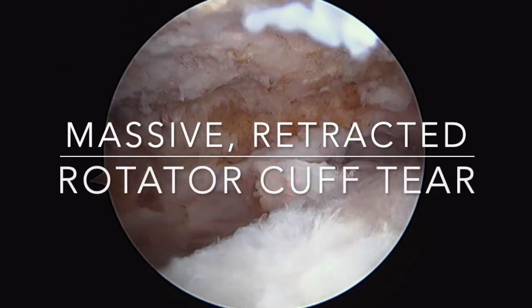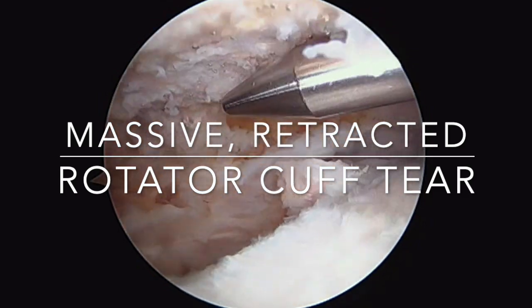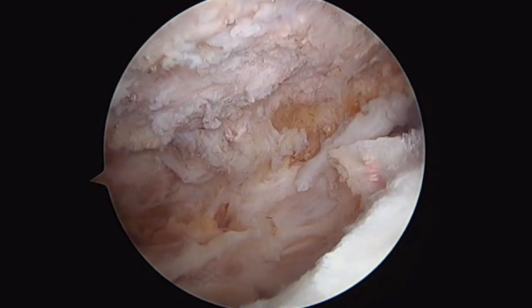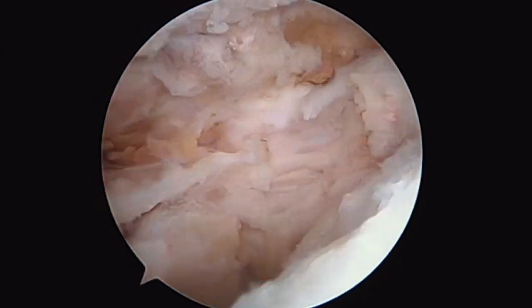We're in this patient's right shoulder. This is the subacromial space. Above us is the acromion and this is the humerus. This is what a massive chronic retracted rotator cuff tear looks like.